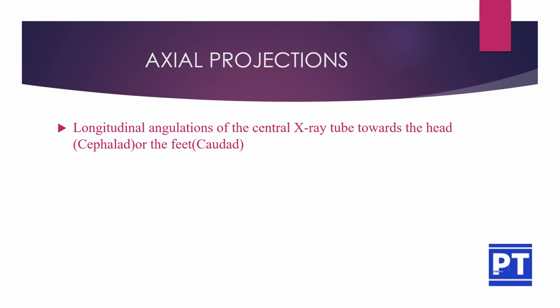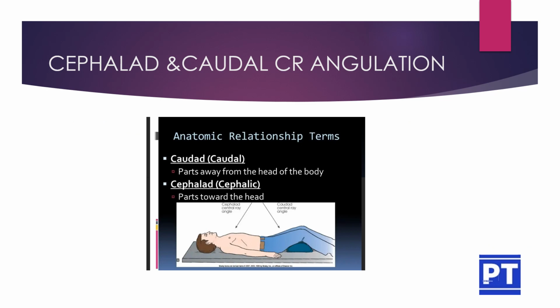Again, we are moving on to the axial projections. Longitudinal angulation of the central X-ray tube towards the head is known as cephalad, or to the feet is known as caudal angulation. This is an image showing the cephalad and caudal angulations.